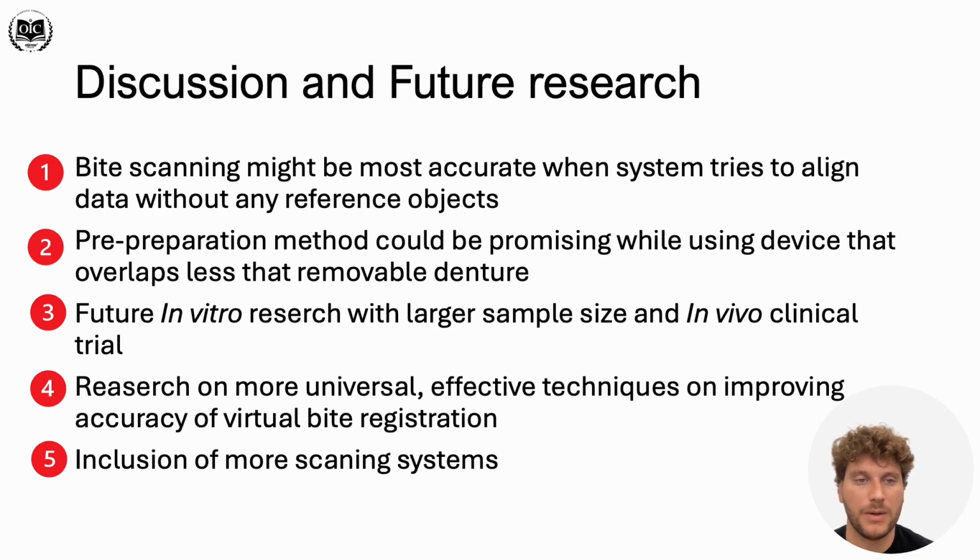The pre-preparation method could be promising due to its ease of workflow, and also this technique can be used with existing fixed restorations or the mock-up try-in restorations that are screwed onto the implants. So in this case, you get better visibility of the palatal area, and you can expect better accuracy.